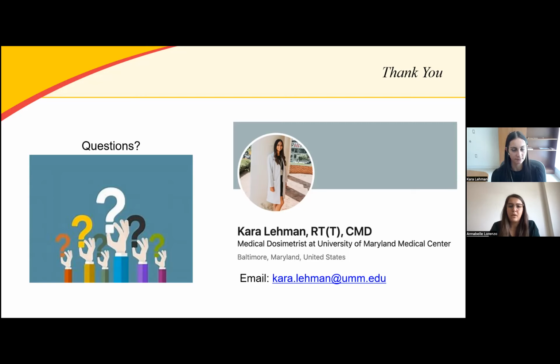Okay. Then we have a technical question. Is it possible to resume the CBCT on the ProBeam system to avoid having to repeat the CBCT from the start if the patient falls out of breath hold? Yes, so it is possible. We actually never do that.